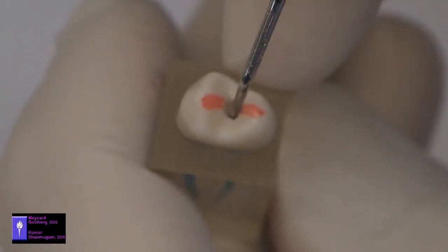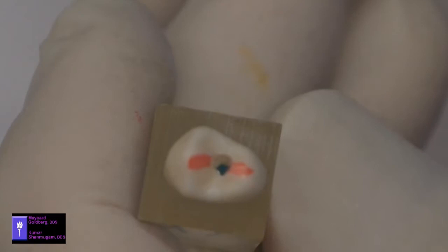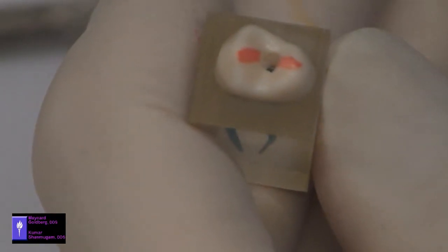The roof has been penetrated, and now I will place my burr just below that penetration, not to the floor of the chamber, and just bring it up to the occlusal height circumferentially.